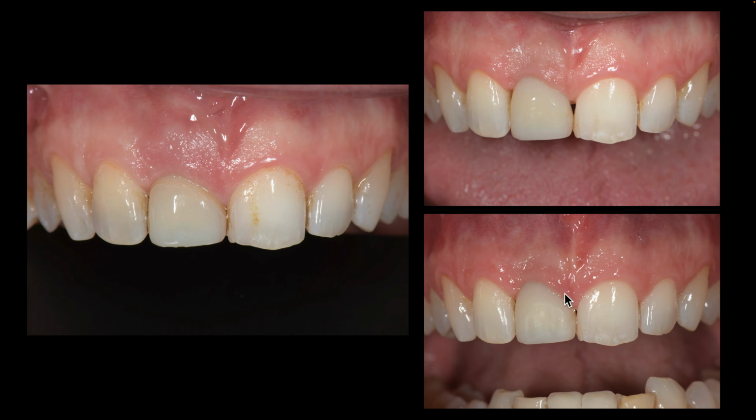So I need to add some contour in through here to change the shape of the papilla. Other than that, it's pretty good. It started out, we had an altered gingival level height. Now we've got the height decent, but the shape isn't quite right.